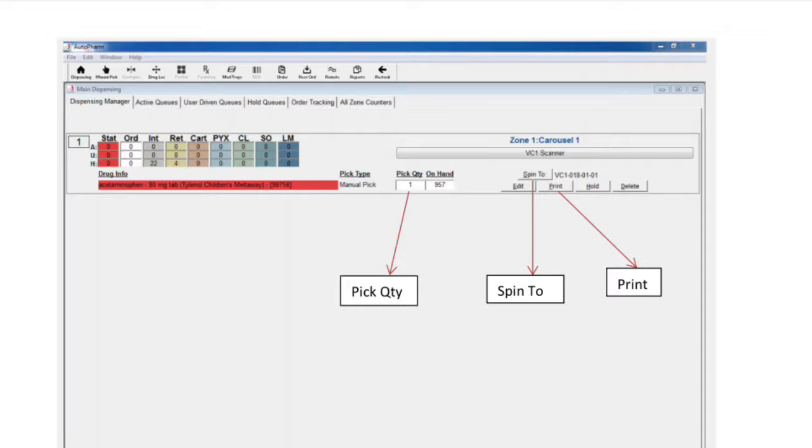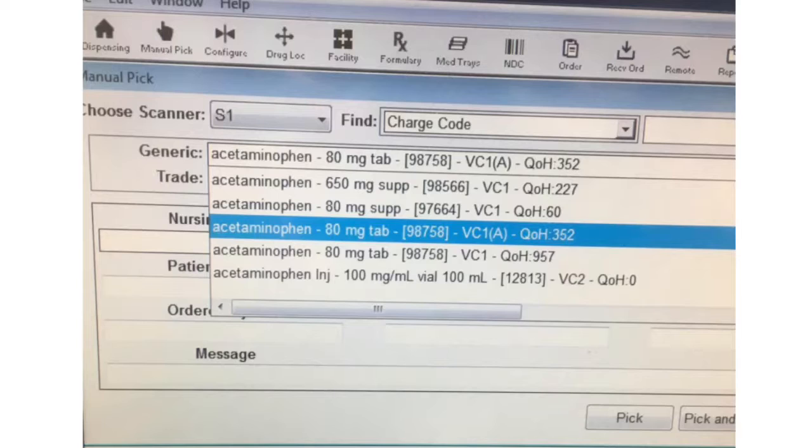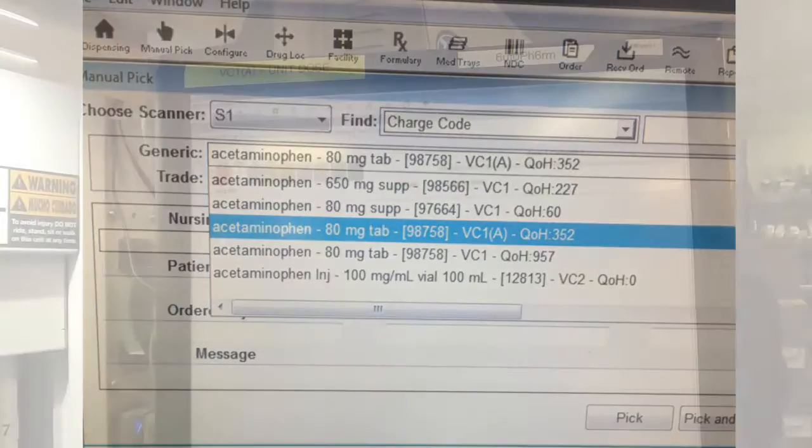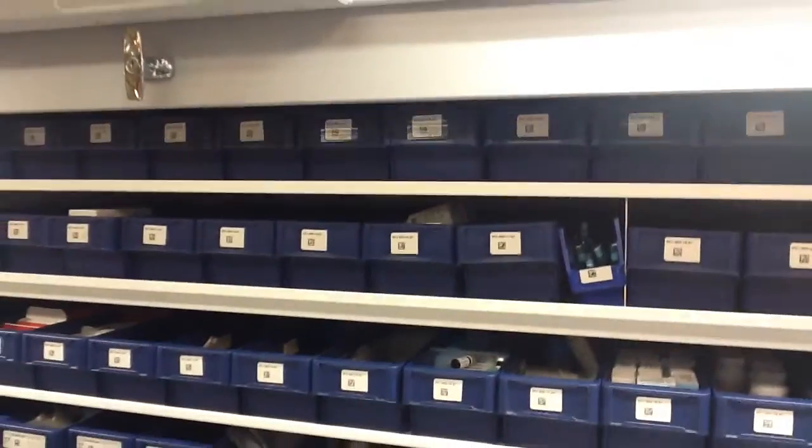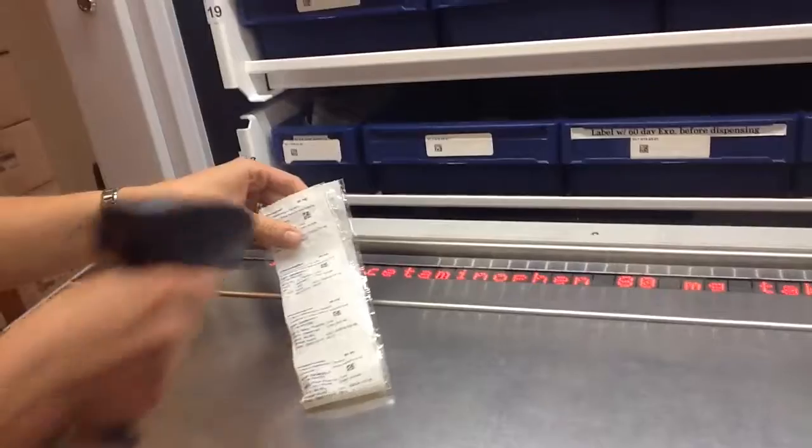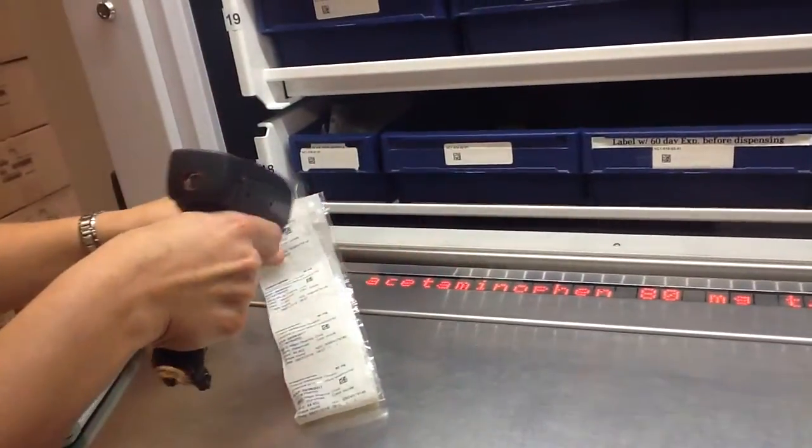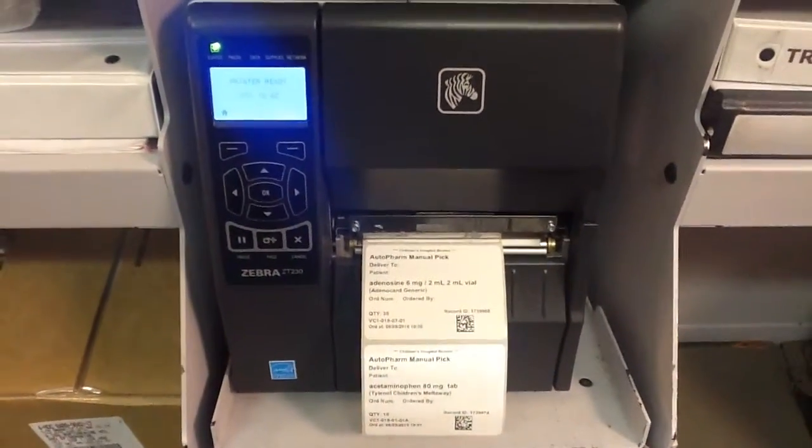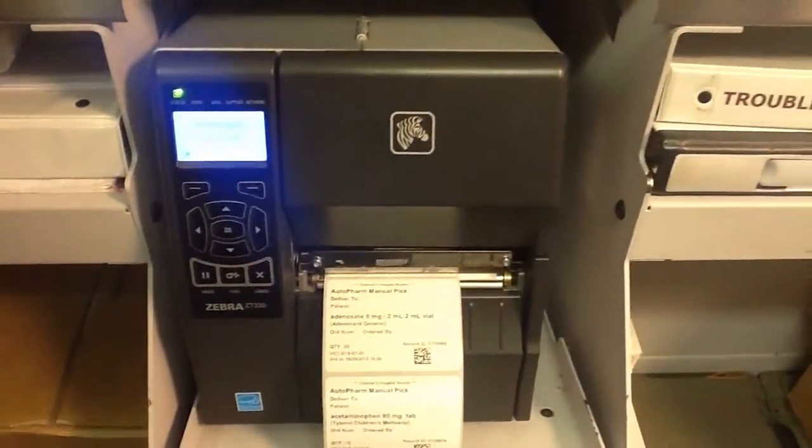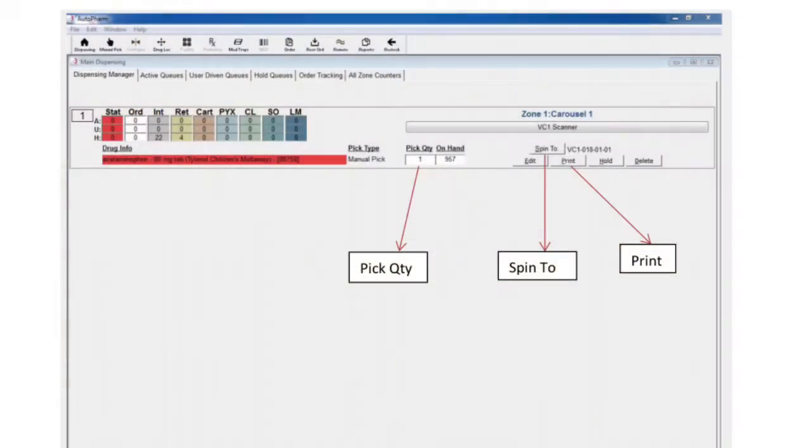After you have selected the medication and filled out the pick quantity, you can choose another medication by selecting pick. If you are finished queuing up selections, choose pick and close. Once you hit pick and close, the carousel will spin, the light bar will light up and the label will print. The location of the medication will be displayed on the light bar and on the screen.